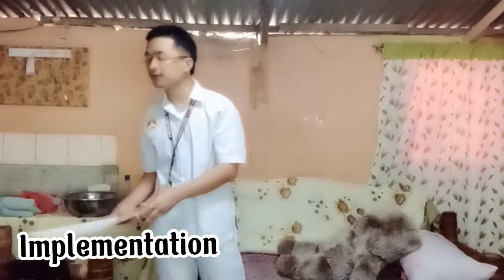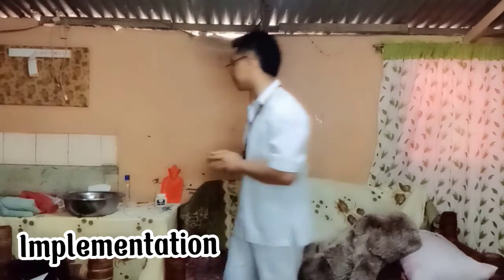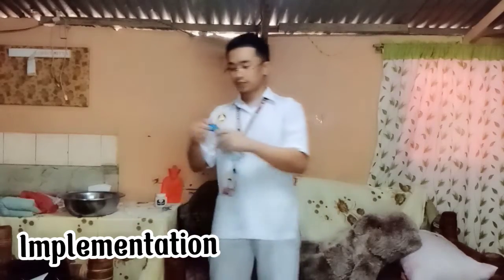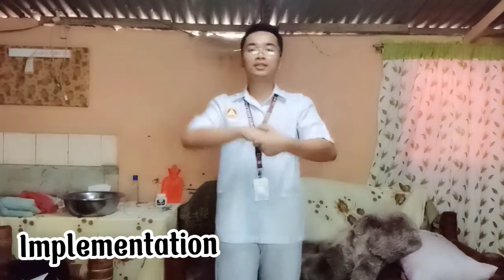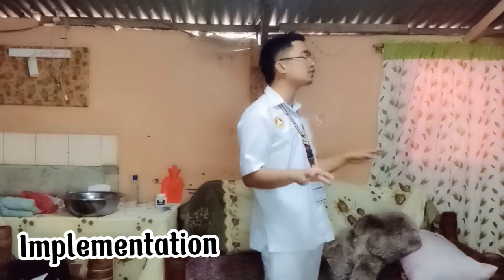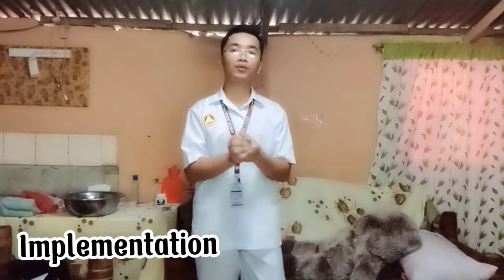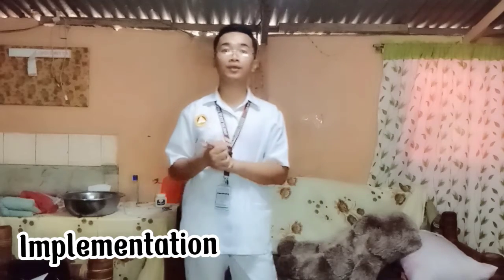Okay, so after explaining the procedure, we're going to perform hand hygiene and provide privacy for our client. So I'm going to perform hand hygiene. Then I'm going to close the door, close the window, and draw the curtain. So as you can see, I already closed the window and the door.